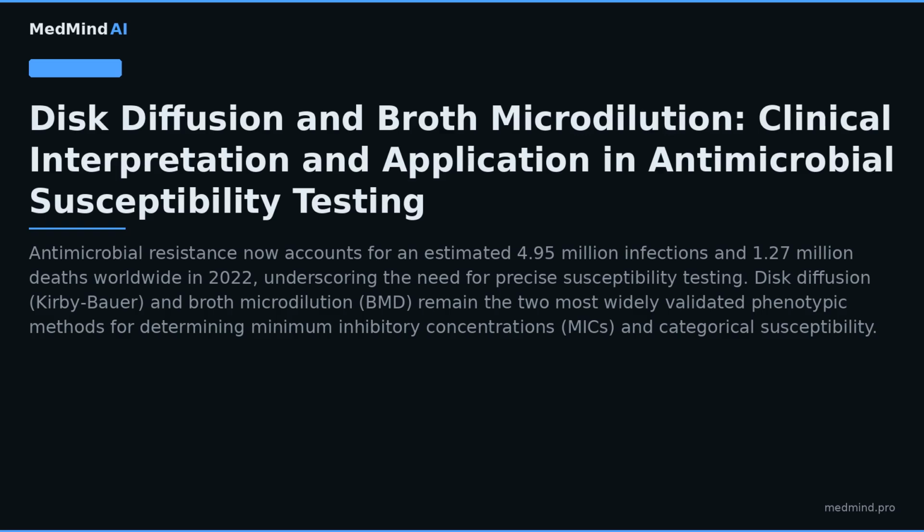Disc diffusion and broth microdilution, clinical interpretation and application in antimicrobial susceptibility testing. Antimicrobial resistance now accounts for an estimated 4.95 million infections and 1.27 million deaths worldwide in 2022, underscoring the need for precise susceptibility testing. Disc diffusion, Kirby-Bauer, and broth microdilution, BMD, remain the two most widely validated phenotypic methods for determining minimum inhibitory concentrations, MICs, and categorical susceptibility.